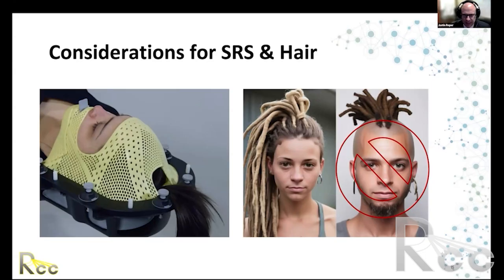So surface guidance would be, those optical cameras would be able to see the true surface of the patient as opposed to just the shell of the mask. So that would be another example of when we would want to expose the patient with an open face mask. I hope that answers the question. If it doesn't, I can pause.